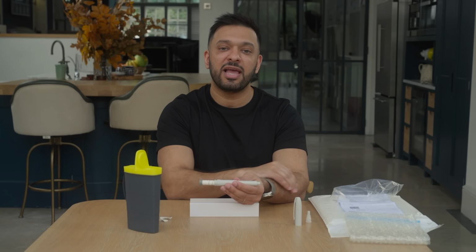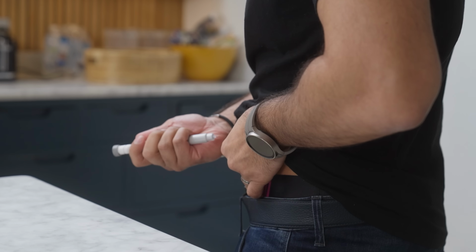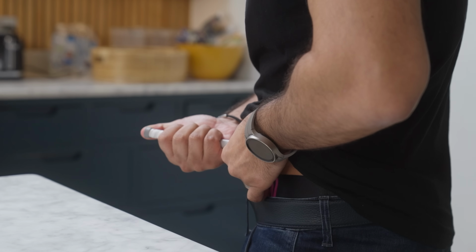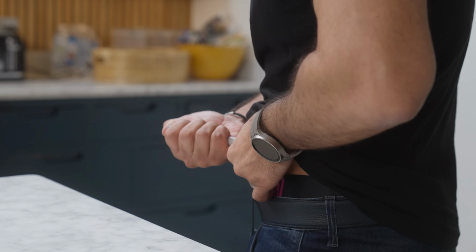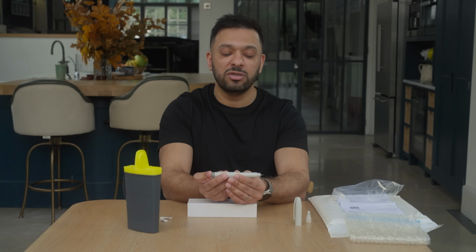Once the injection site has been chosen, pinch the skin nice and tight and insert the needle at a 90-degree angle. Push down the plunger all the way until the number 0 appears again in the treatment window, and hold the needle in place for 10 seconds to allow the full dose to be administered.